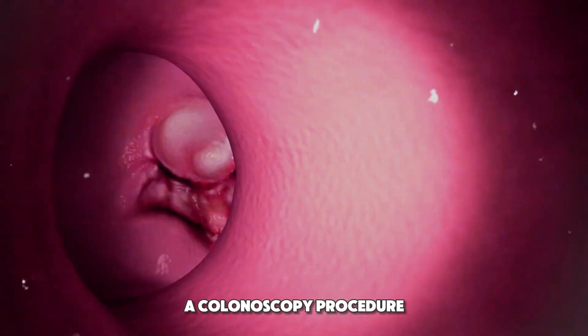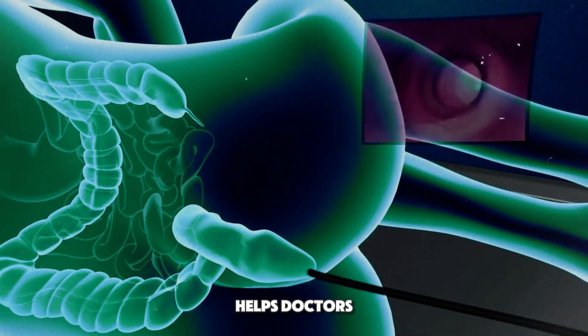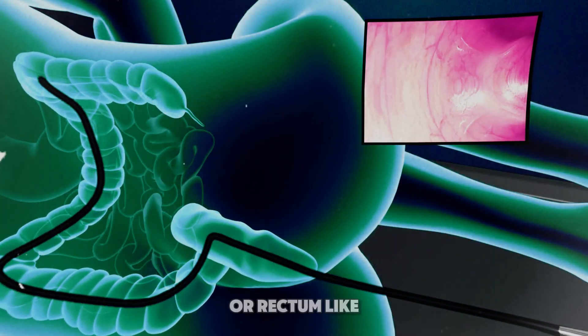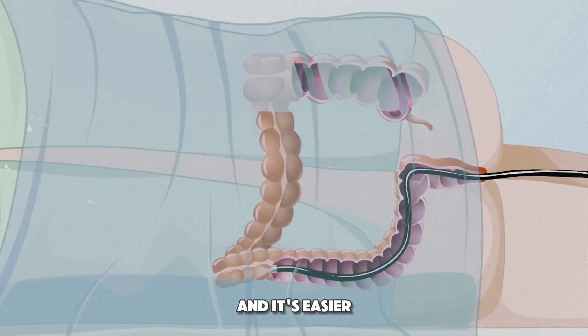Ever wondered how a colonoscopy procedure is performed? It's a key test that helps doctors spot issues in your colon or rectum, like cancer or inflammation, and it's easier than you might think.